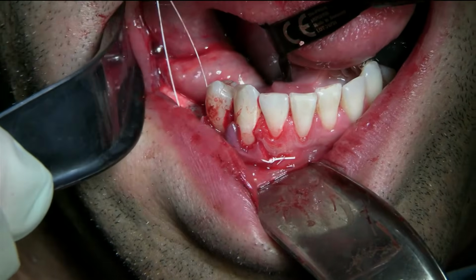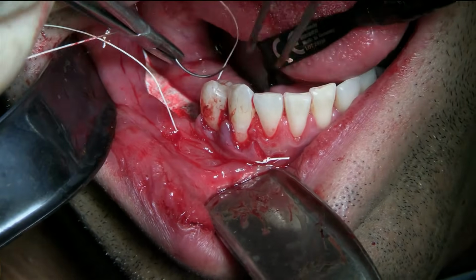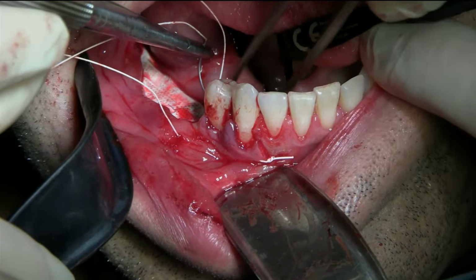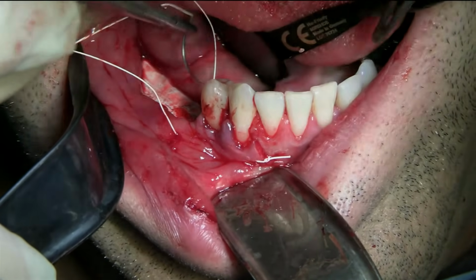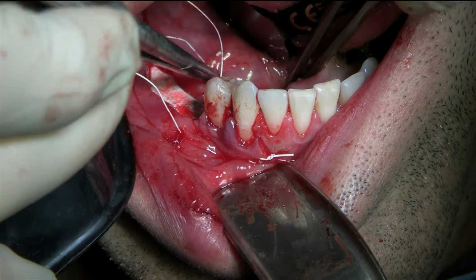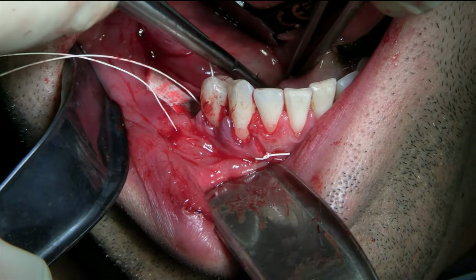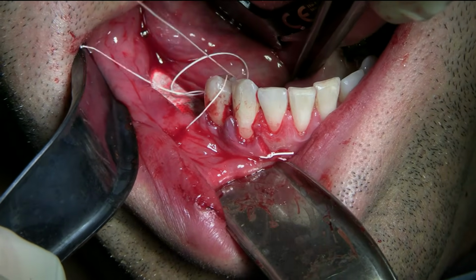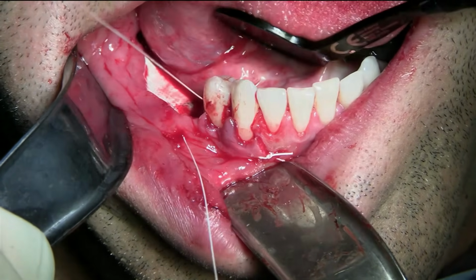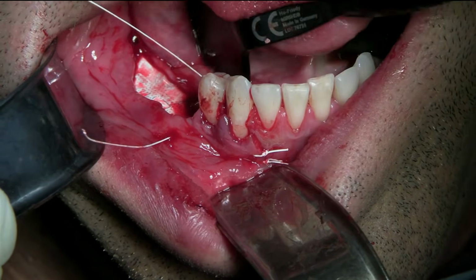Now I got to grab the lingual. Oh God, open wide. Yeah. Where are you? Okay, I got it. Again, also in the lingual, I'm going deep, meaning like about 4 millimeters from the margin. Now I'm coming back from the lingual.